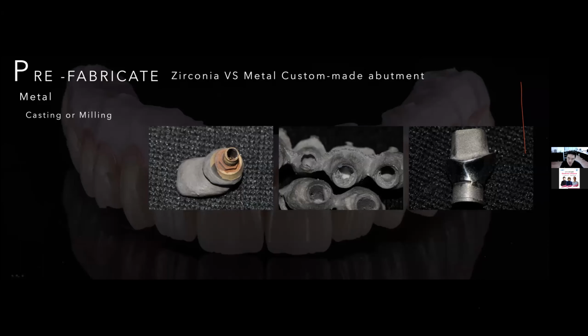So sometimes I recommend to my dentists that they use a standard abutment or choose a milled abutment. Don't use casting. And now semi-precious alloy or gold alloy is more expensive. Nowadays, I never do casting abutments anymore.